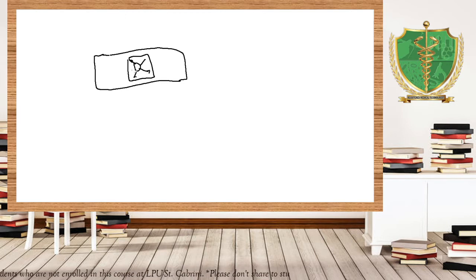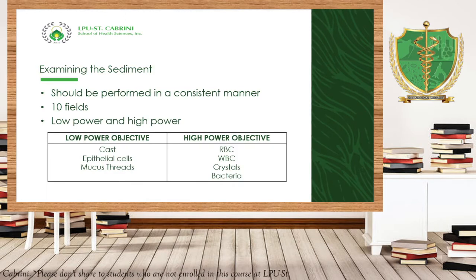And then namumove niya po yung mga sediment, and usually cast will be seen near the edges of the slide, no? Kaya po the side by side of the cover slip should be tested, to detect or to see if there is a presence of cast rather. Okay? So the examination of the sediment should be done under low power field and the high power field.